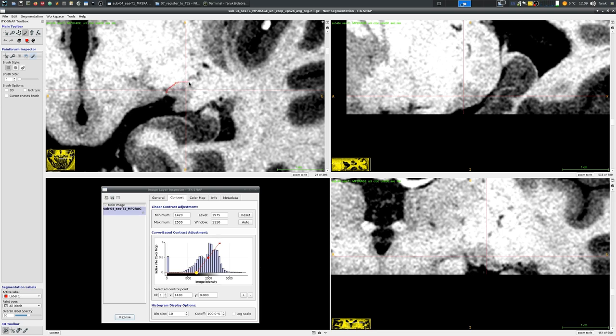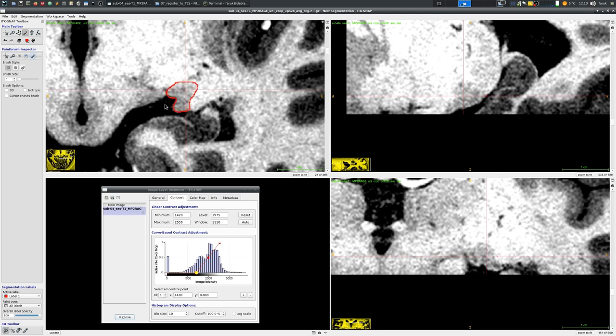Here you can see that now I'm going to draw the border around a single slice of the brain image where I can see the lateral geniculate nucleus structure. Using the lower left panel I can adjust the opacity of this red line that I have labeled and there are also keyboard shortcuts that you can use for instance S, A and D buttons.